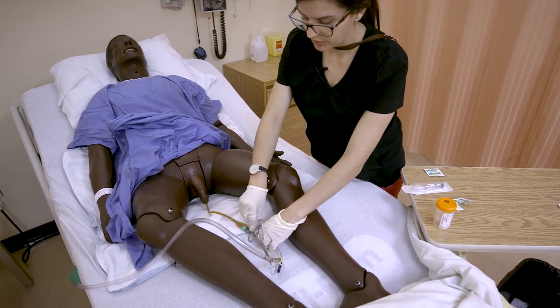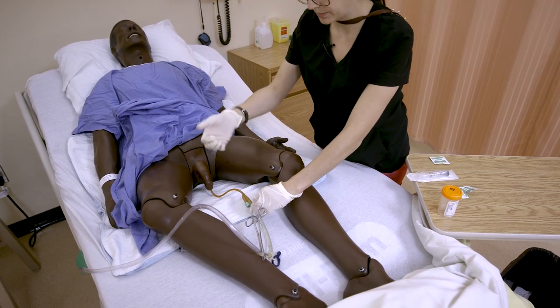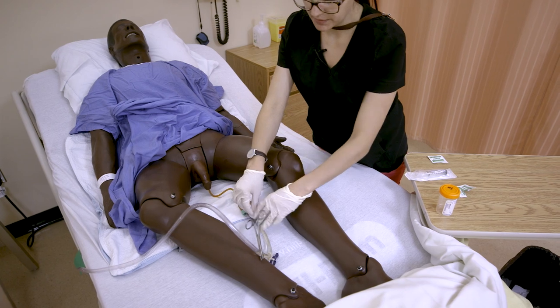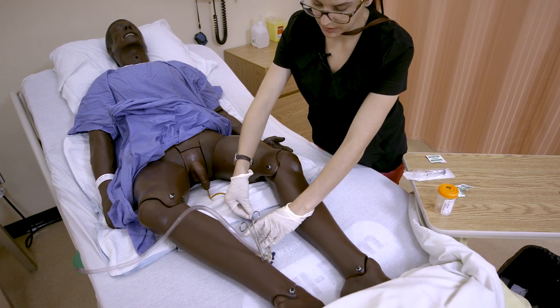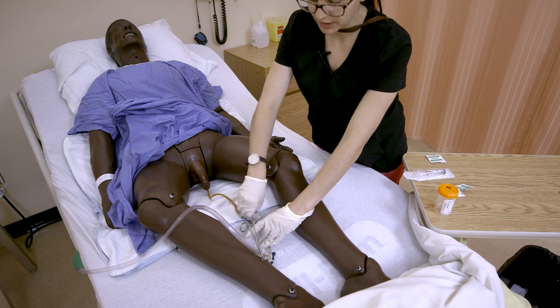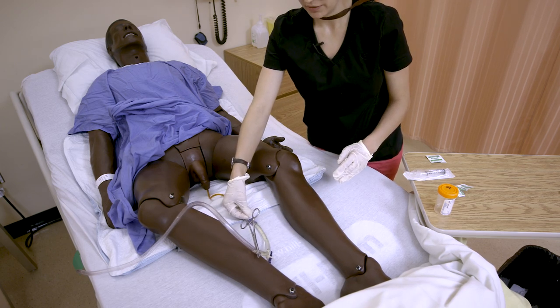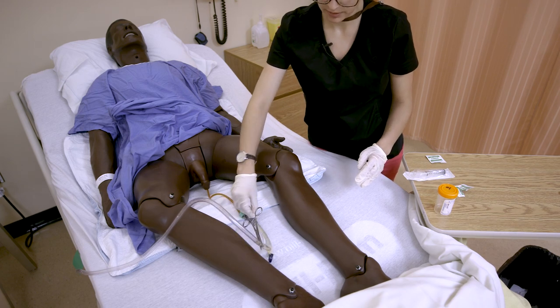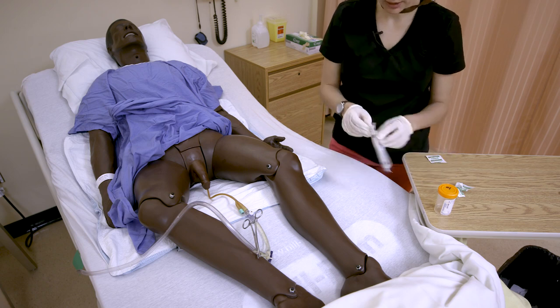You don't want to disconnect the system — you might wonder why not just pull it apart and put the catheter into the sterile specimen container. But we want to keep a closed system as much as possible with a Foley catheter, because opening the system creates potential for introduction of microorganisms. So we clean that port really well and let it dry for 30 seconds.